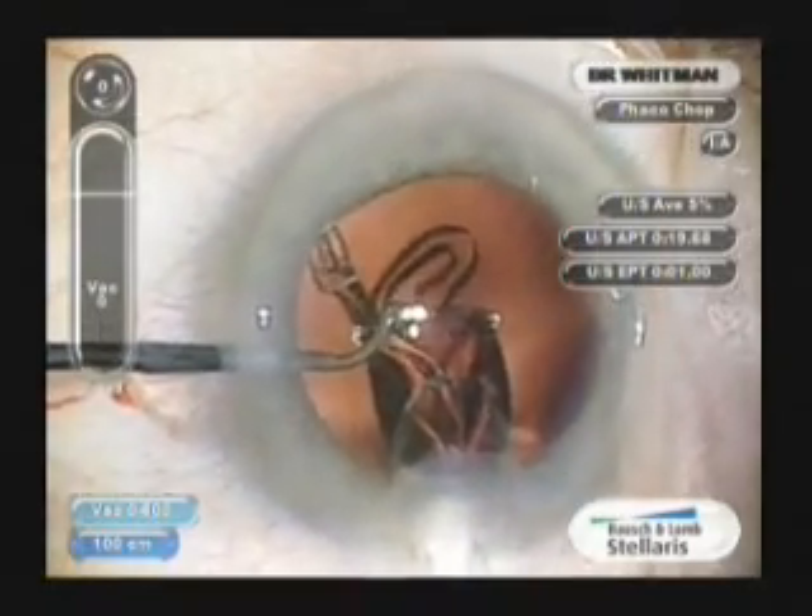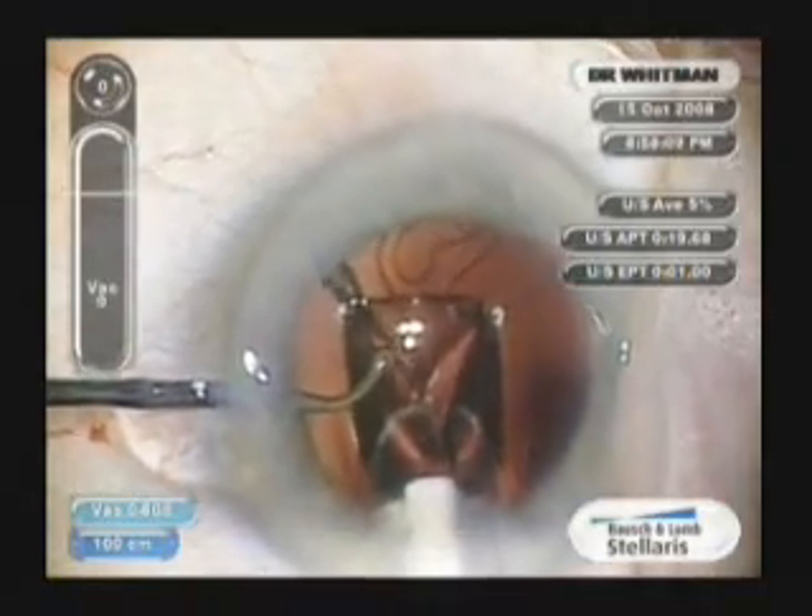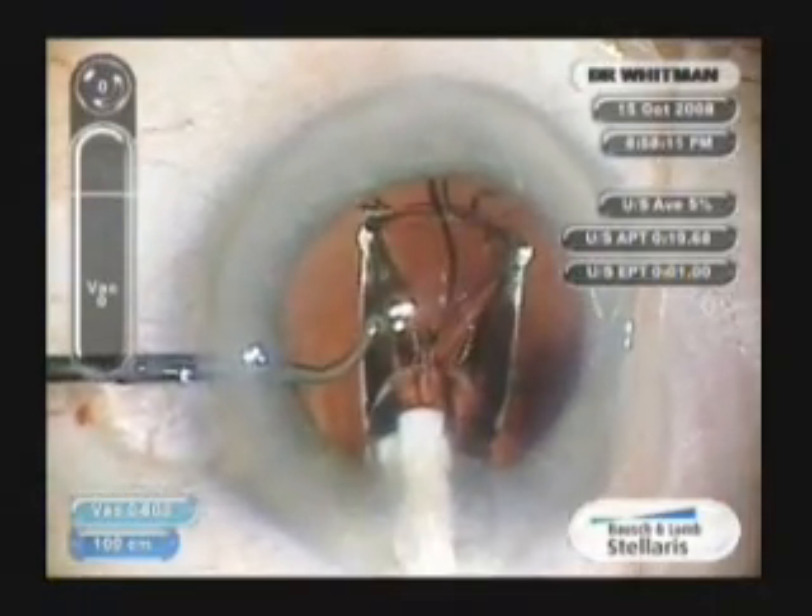You can see a little bump on the right leading haptic, so you know you have the lens right side up, and you simply continue to inject.